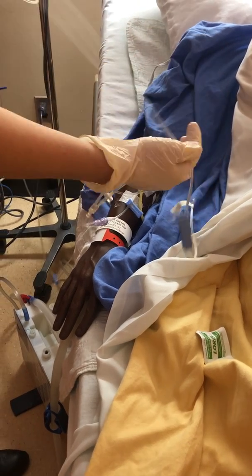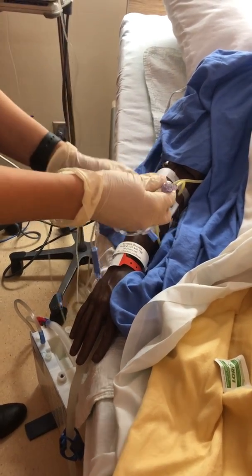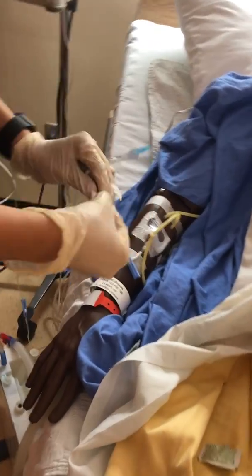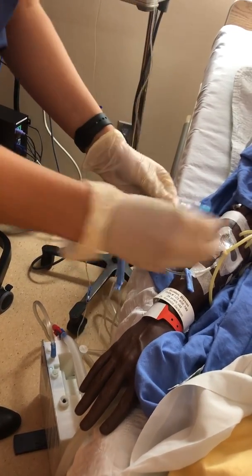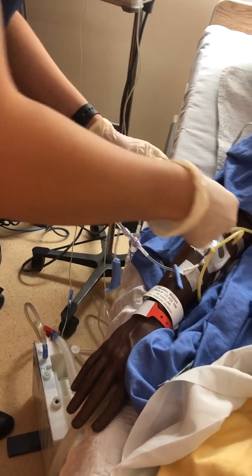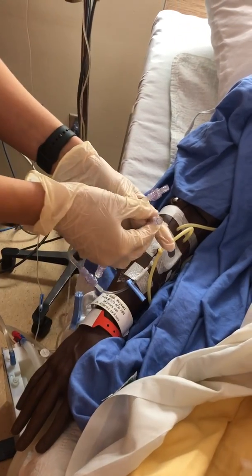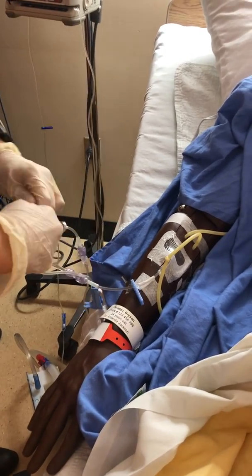And this is the line I'm going to be hooking up to the other port here. So I want to alcohol swab this for 30 seconds. Let it dry for 15. And then I will be taking this off here, so as not to contaminate either end, and then connecting them.